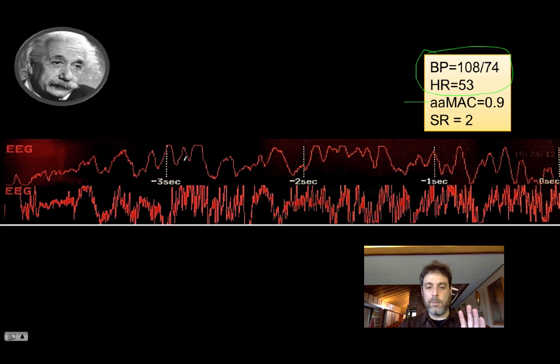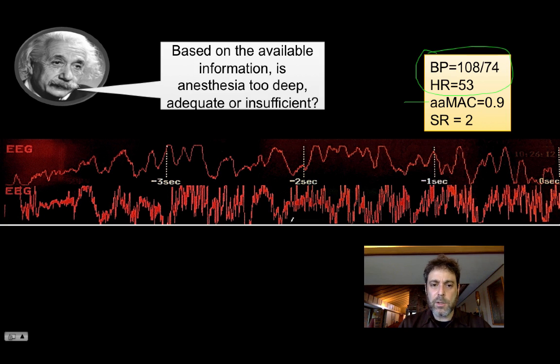Well, sorry, it's not per millimeter. The scale is probably more like 7.5 microvolts per millimeter, but the scale of the BIS isn't given as per millimeter. It's just given as the scale for the entire EEG. So 1, 2, 3, 4, 5, 6, 7, about 7 Hertz over there. So actually theta wave territory, very nice prominent big delta waves there, probably less than 1 Hertz.